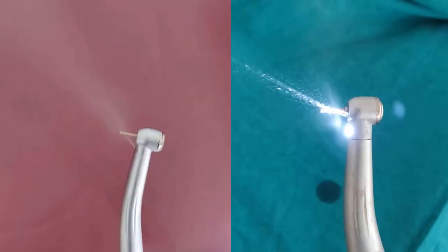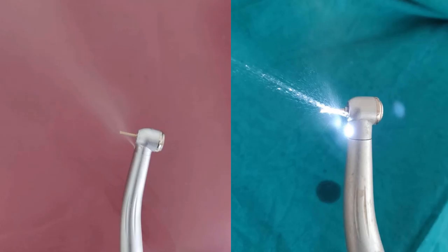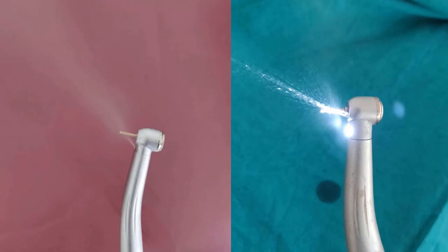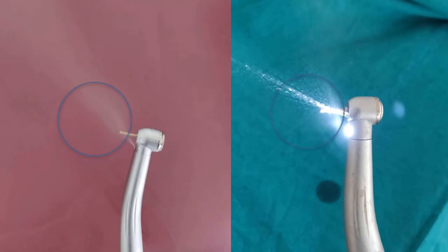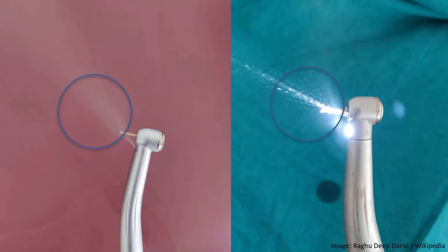Why is dental aerosol generated? During a dental treatment, various tools and devices are used. Dental aerosol is produced from dental instruments like ultrasonic scalers, dental handpieces, three-way syringes, and other high-speed instruments. Images here show generated aerosol through a handpiece.